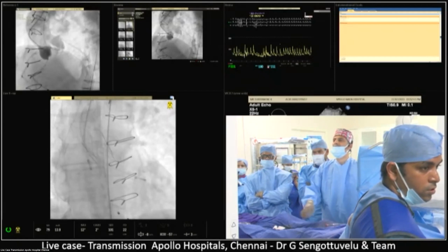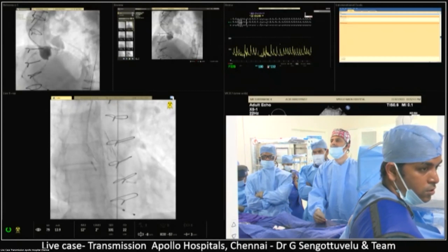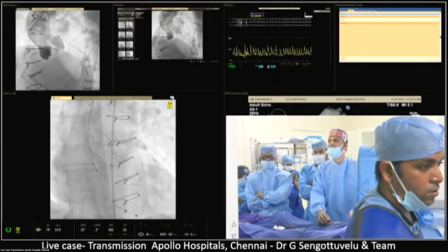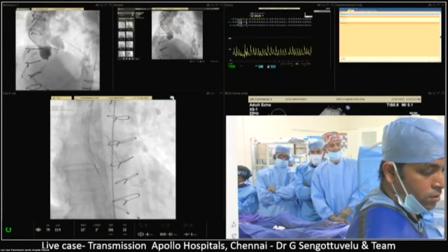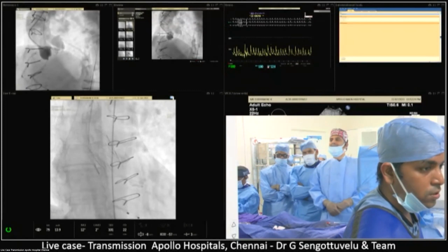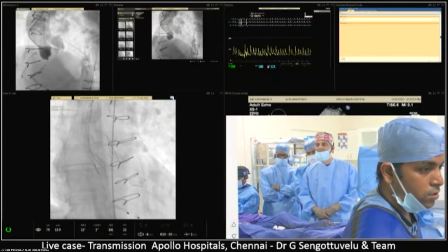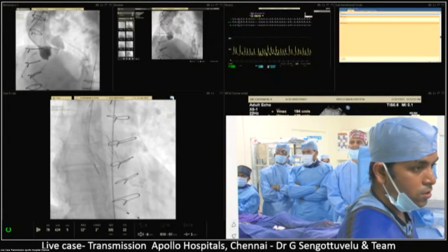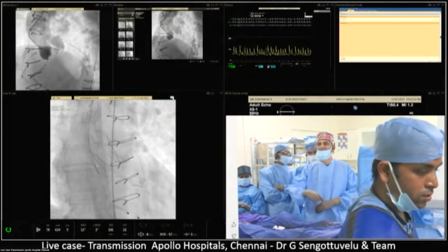Before we leave, can you maybe, for the audience, highlight the challenges with the wire? When you have a second, go back to the fluoro image. It's very important not to lose the access to the LV. So the pigtail is very important. I don't want the pigtail or the wire to come out for any reason. It's very difficult to recross an Accurate because you have large open cells and you can cross through the struts.